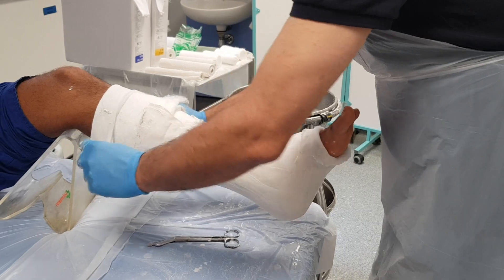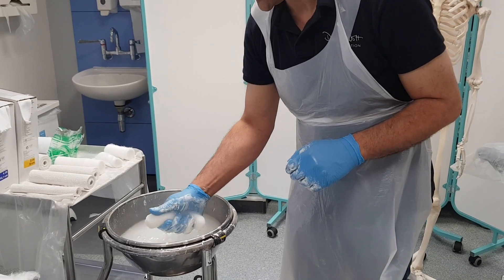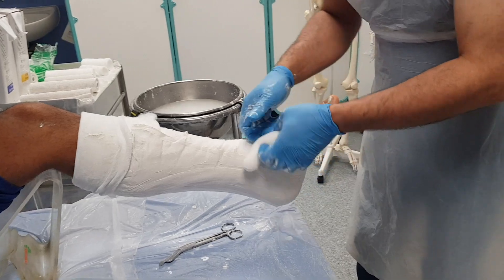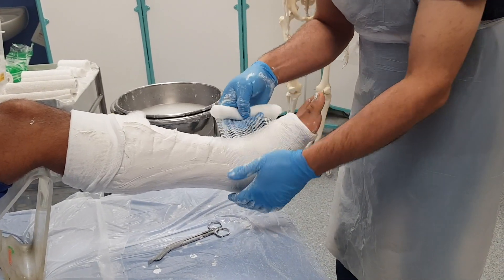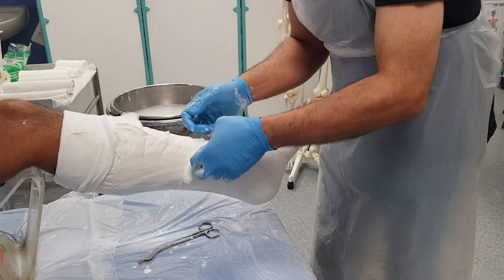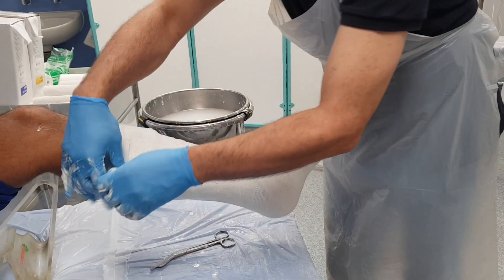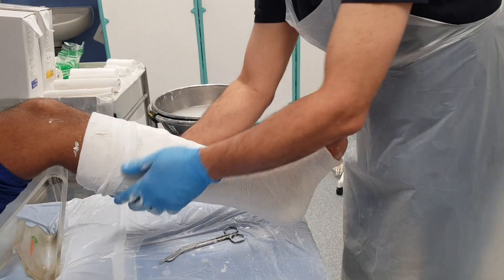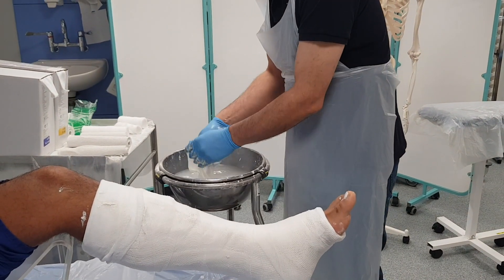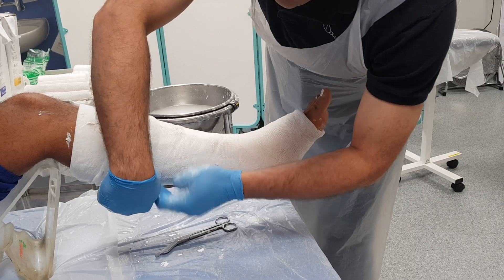I can fold down the stockinette so that it exposes the metatarsal heads, and I need to fold down at the top as well. Then I can take my crepe bandage and start at the bottom end to wrap this around. It would be a good idea to use quite cool water because you need more time to apply the plaster and also to get the right position. I'm going to use a little bit of spare plaster to hold the end of the crepe bandage in place.